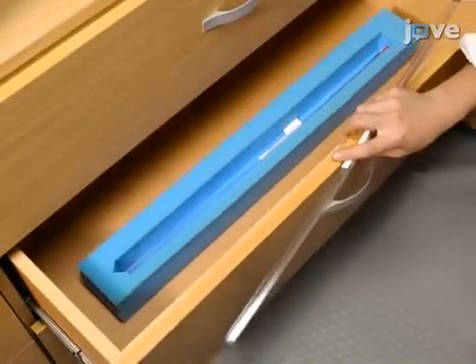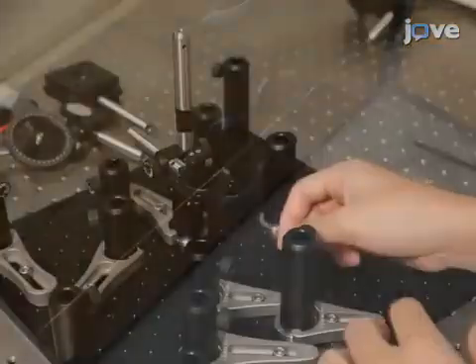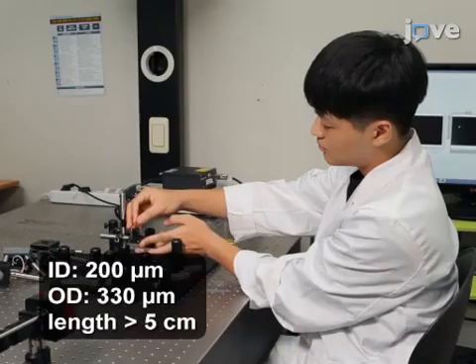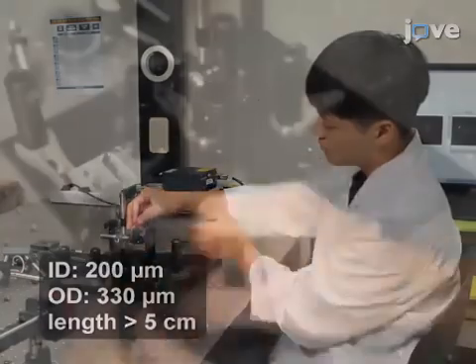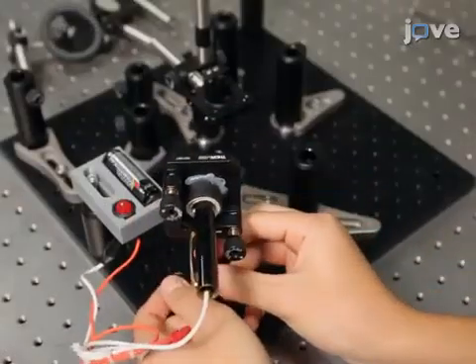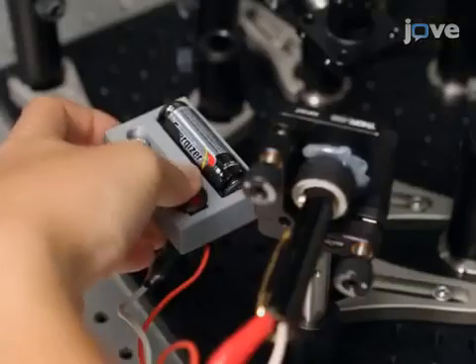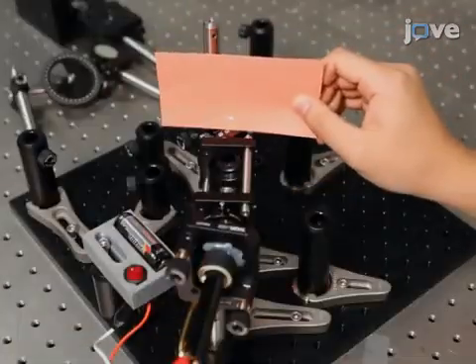To begin setting up the photothermal angular light scattering sensor, first mount a clean capillary tube upright on a capillary tube fixture. Then, mount a 650 nanometer probe laser directed at the tube. Turn on the laser and check the scattering pattern with a sheet of paper.